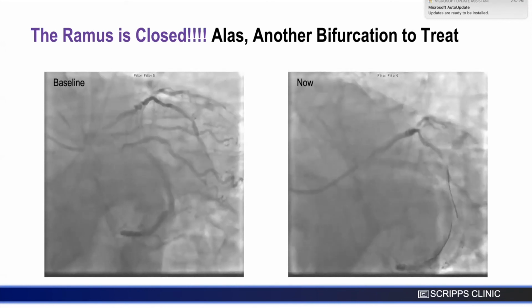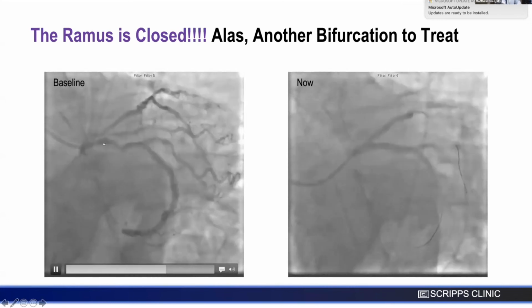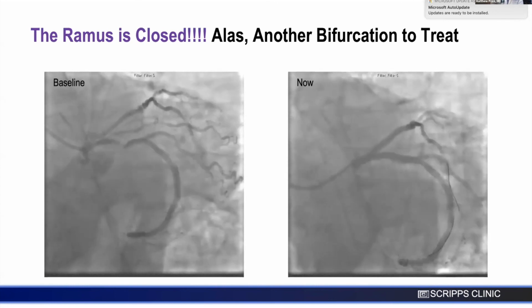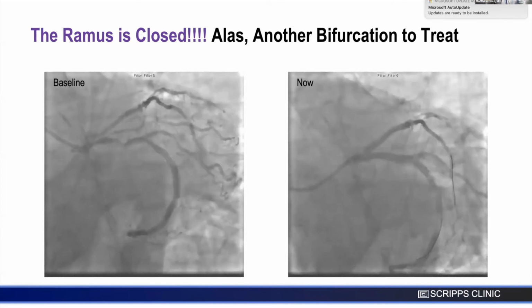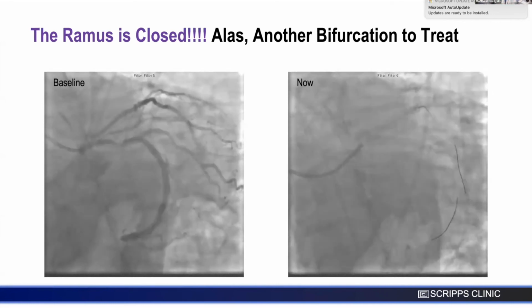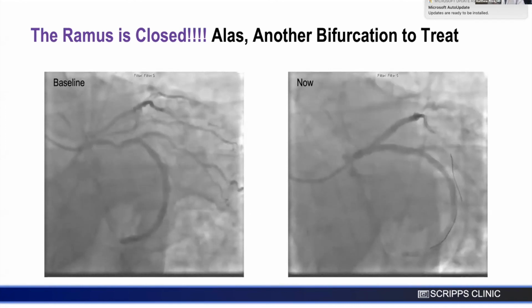It was actually quite like two layers now, so good luck. Well, I made sure not to double cover. We didn't even talk about this, but a great point when you're laying in stents is not to double cover bifurcations. So for example, if you're doing an OCT-guided precision PCI and you've got 65, 70 millimeters of vessel to treat, you don't necessarily just split it into two, because you want to make sure that your stent doesn't land at a side branch. Because if you put in two stents, you overlap them.